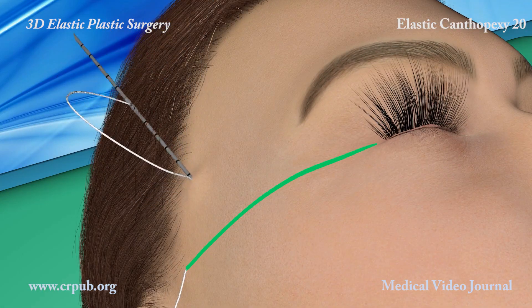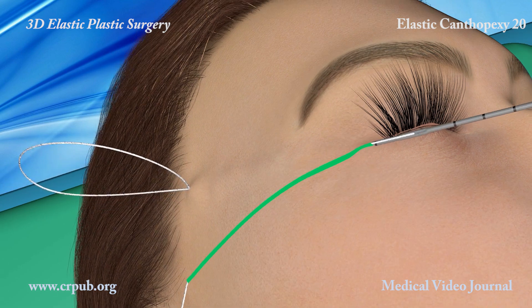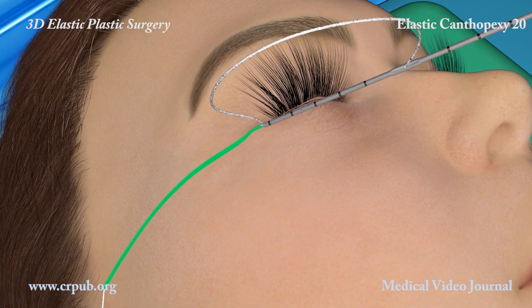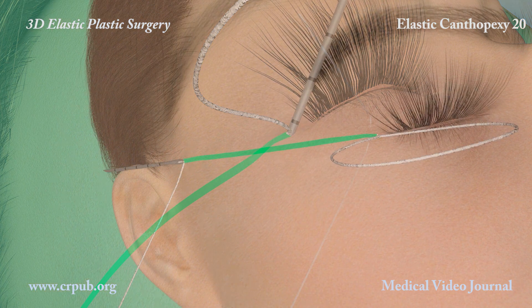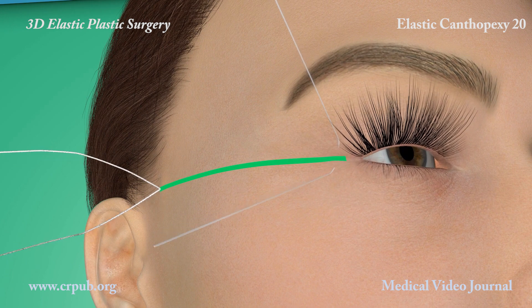The Jano needle is partially extracted. It is then rotated and travels through the superficial subcutaneous tissue in the direction of the canthus. After travelling through the superficial subcutaneous tissue, the two-tipped needle emerges from the small skin incision.